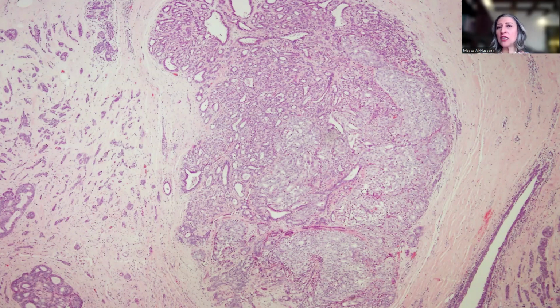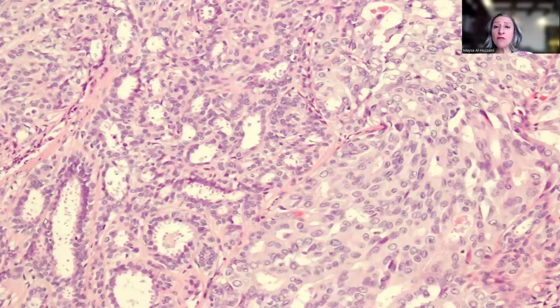This is very tricky because if this was the only lesion present, it sometimes might be difficult to separate the sclerosing adenosis, this part of the lesion, the benign but exuberant proliferation of the glands, from the malignant ductal carcinoma in situ or even invasive carcinoma.